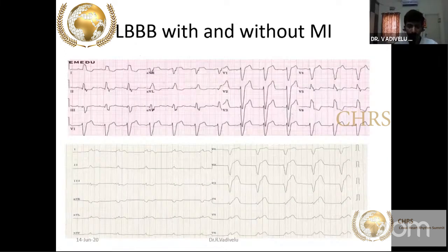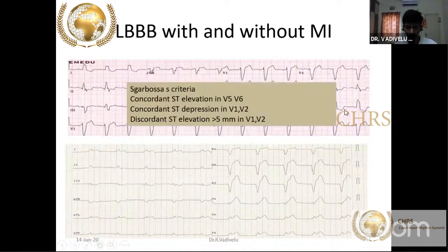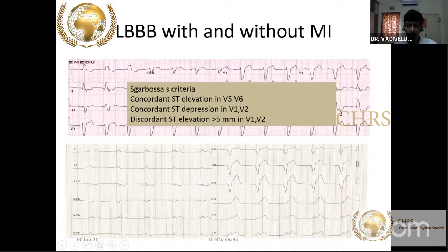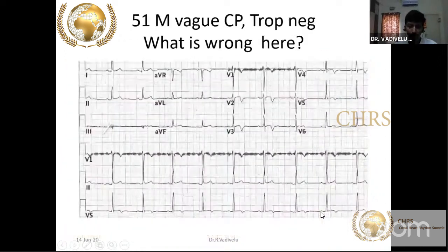The upper ECG strip shows non-ischemic LBBB where V5 and V6 show inverted T waves and ST segment depression. Whereas in the bottom strip, there is concordant ST segment elevation with upright T waves — very classical of ischemic LBBB.